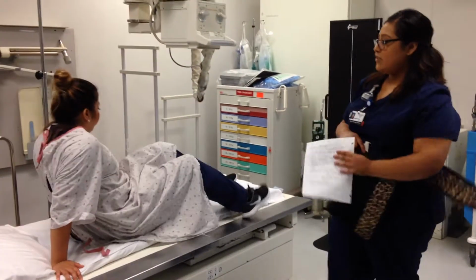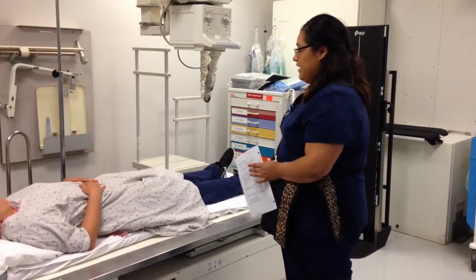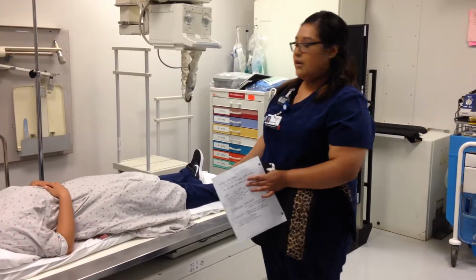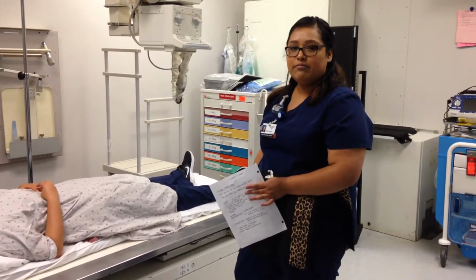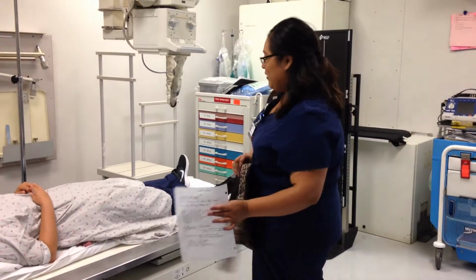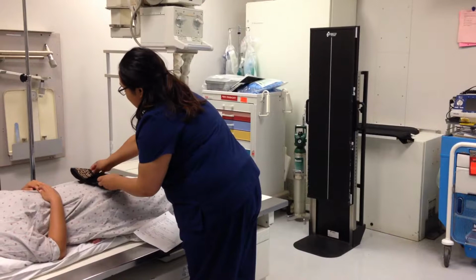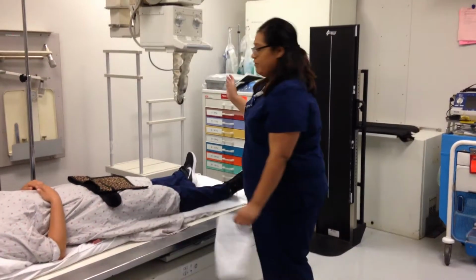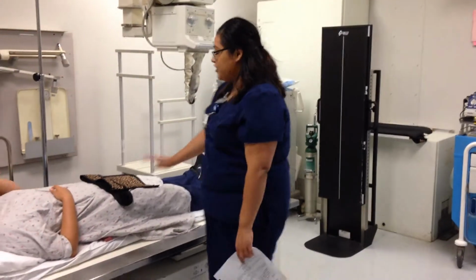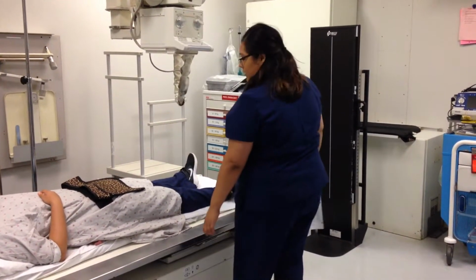And my patient's already changed into a gown. We want to make sure that any pants from the waist down, like jeans or so, are removed just because they're a little trickier to move up towards the knee, and we'll be needing that away. But for the sake of the demonstration, she has her pants left on. I'm going to be shielding our patient, of course, and moving the table just a little higher.